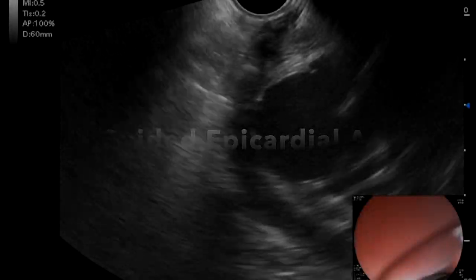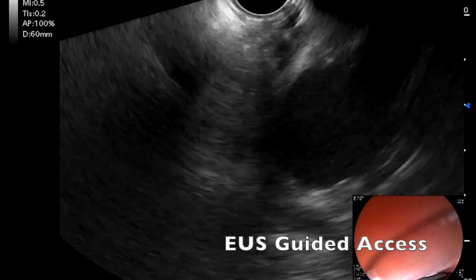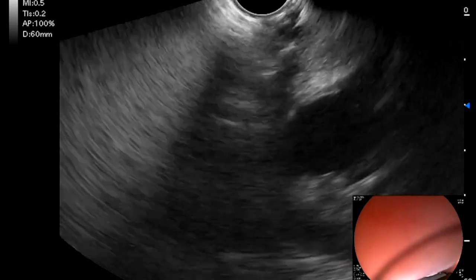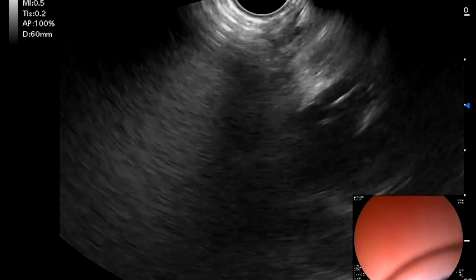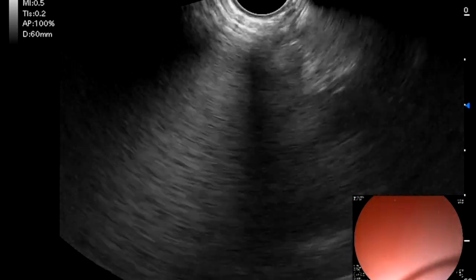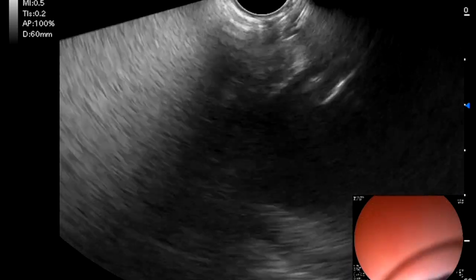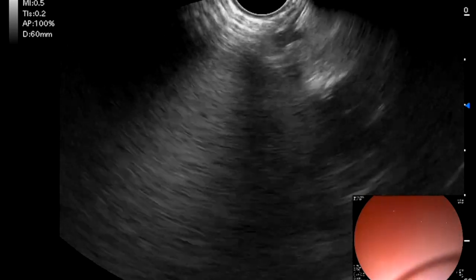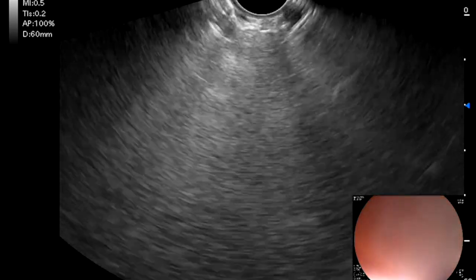The second experiment we conducted was EUS-guided epicardial access. This method precludes the use of dissection through the esophageal wall and instead directly accesses the epicardial space. Using a curved linear EUS scope, we identified an area of the left ventricle in close proximity to the esophagus. We used Doppler to identify an area free of epicardial vessels in order to avoid injury and hemopericardium.